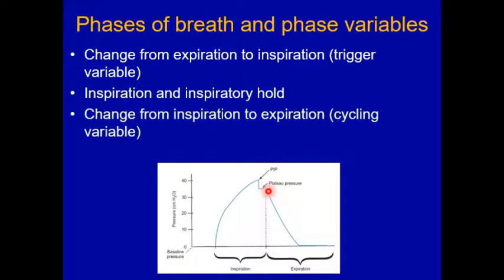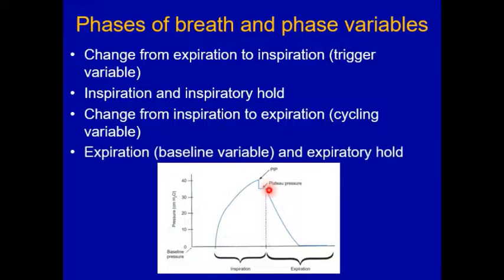Then we have got the changeover from inspiration to expiration. This changeover from inspiration to expiration is called cycling. So what cycles or what changes from inspiration to expiration? That is called the cycling variable. And then we have got expiration, that is the expiration and the expiratory hold.